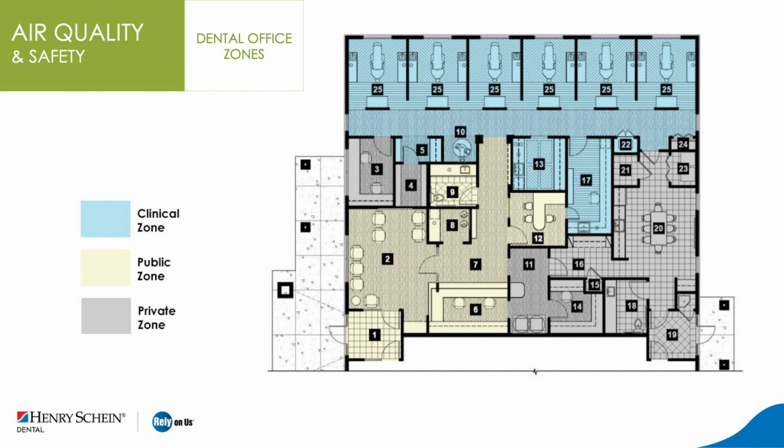So we're going to focus on air quality management in the operatories to minimize and contain the aerosolization of viral and bacterial particulates. And because dental care is mostly elective and care of the medically compromised patient is generally deferred, there's going to be a hyper focus on individual patient care rather than on unit care.